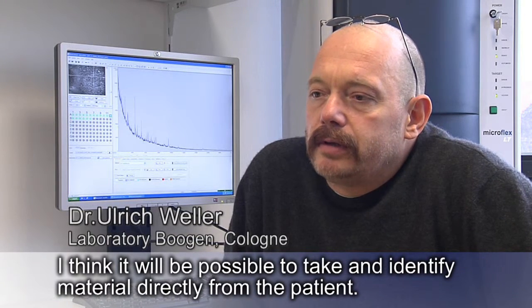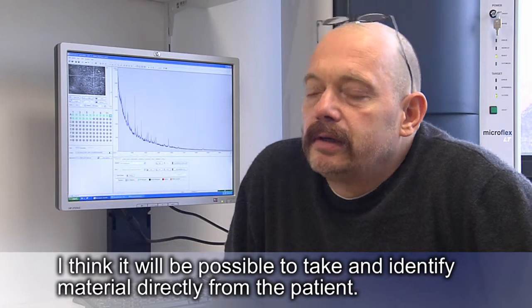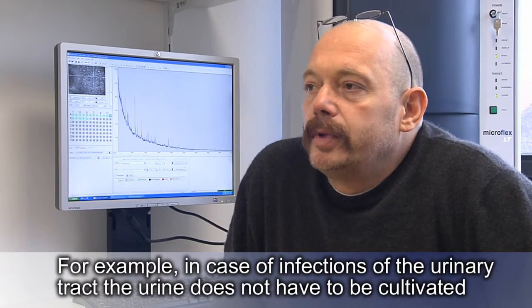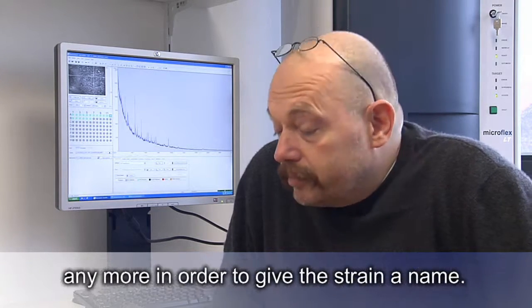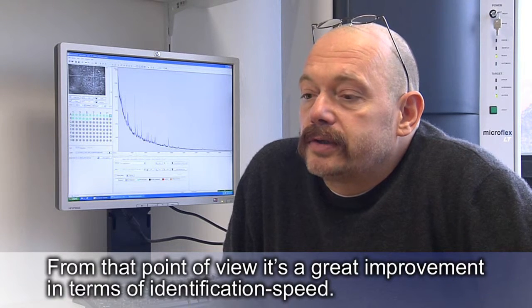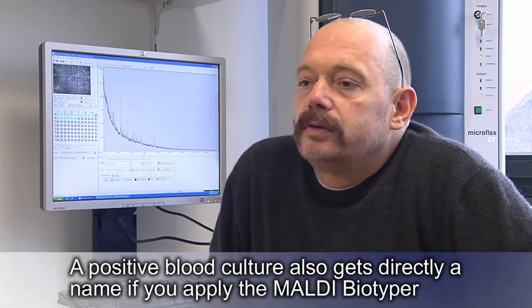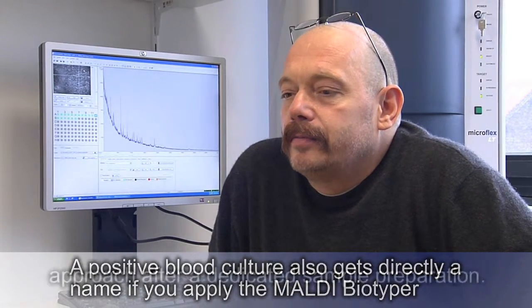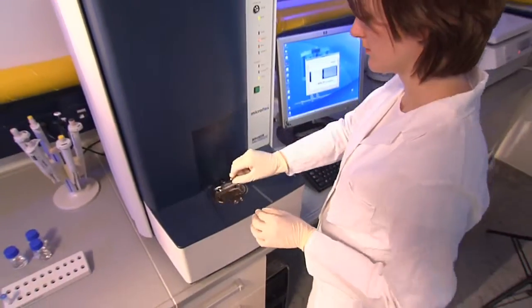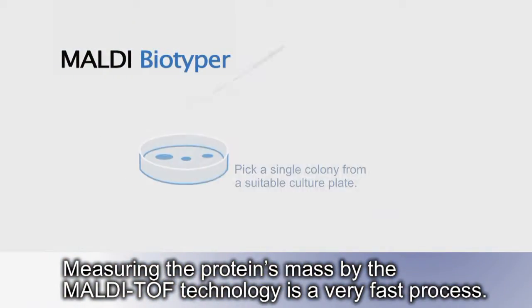I think it will be possible to take and identify material directly from the patient. For example, in case of infections of the urinary tract, the urine does not have to be cultivated anymore in order to give the strain a name. From that point of view, it's a great improvement in terms of identification speed. A positive blood culture also gets directly a name if you apply the Maldi Biotyper approach after a dedicated sample preparation. Measuring the protein's mass by the Maldi TOF technology is a very fast process.